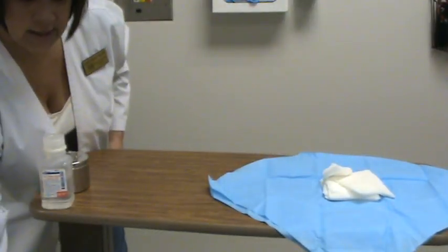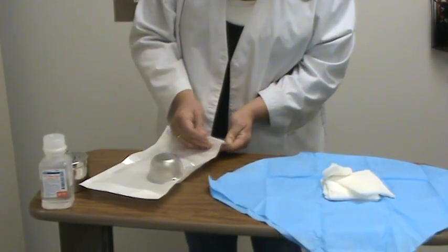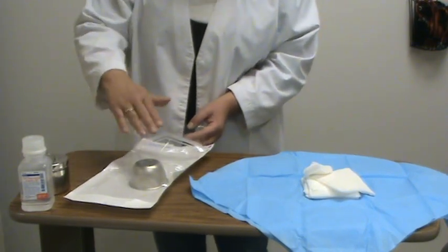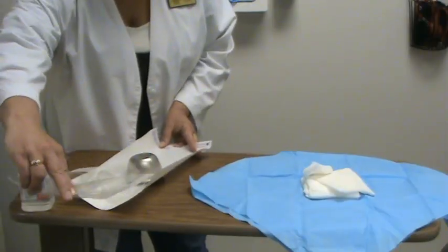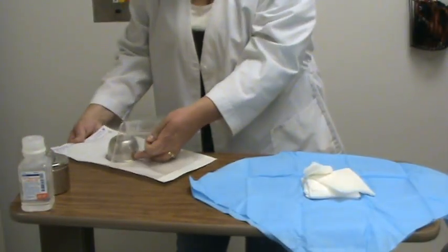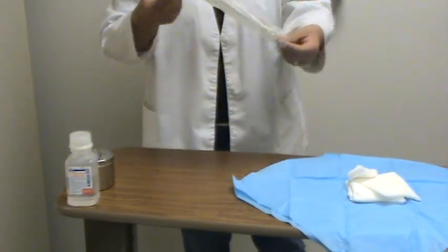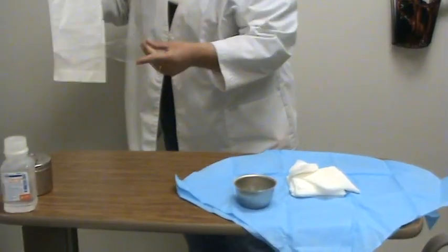The next portion of this demonstration is adding a bowl onto the sterile field — this is what can get a little bit tricky and will take some practice. Make sure the opening of the bowl is down and the plastic is on top. Open it up, only touching beyond the glue. Bring it in from the side and drop it — I'm within my border, so I'm okay.